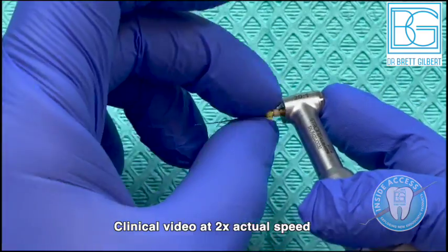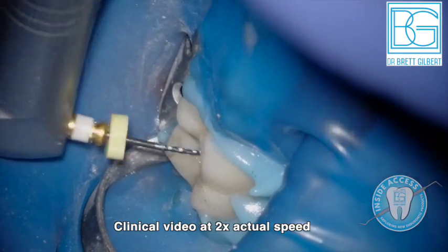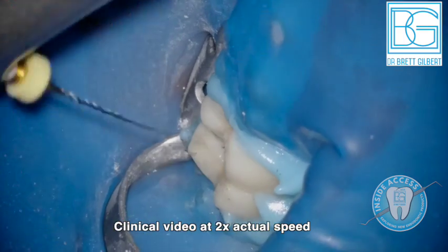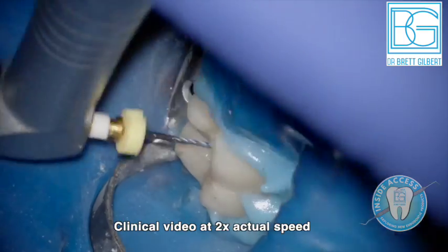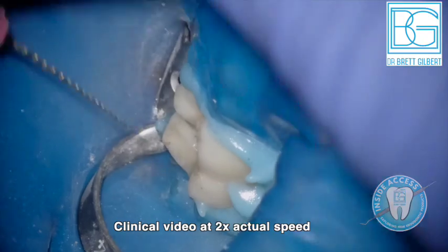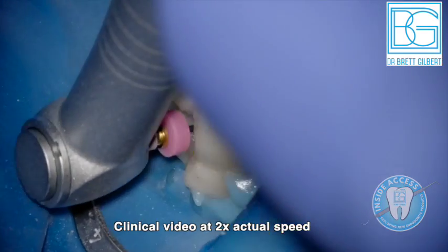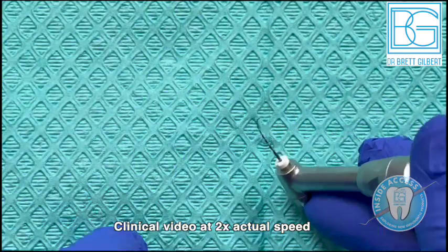After irrigation and apex locator confirmation, we move to the glide path file — a 14/03 taper. You can see nice flexibility and control memory; it just goes down. I have incredible respect for where this file is able to go, which I've never really experienced before. Here's the S1 at 17/03 — now that the glide path has established the path, this essentially sinks right down to the stopper. Always irrigate.